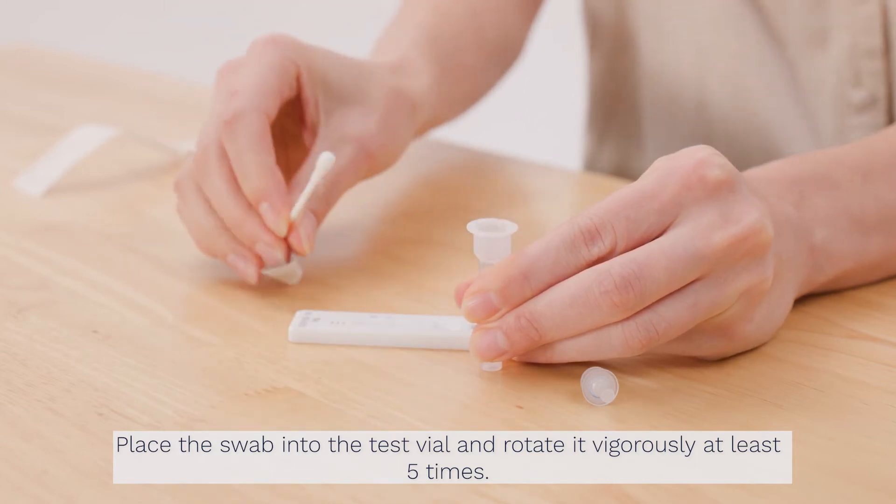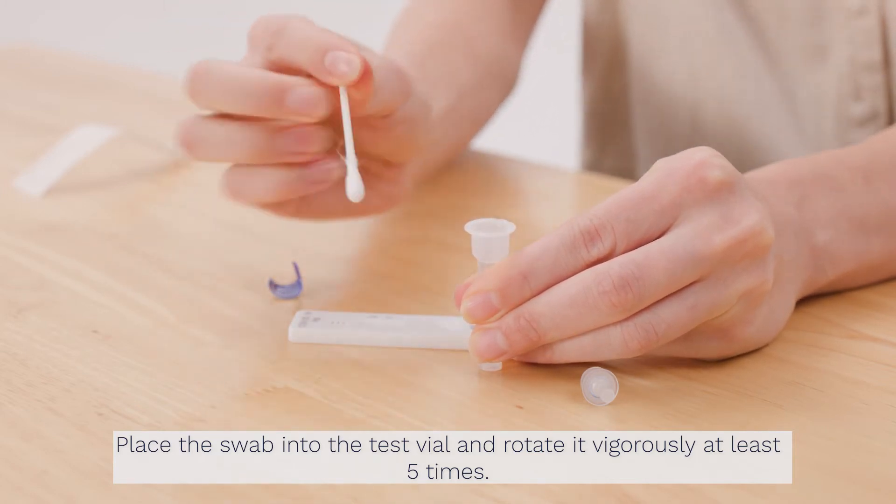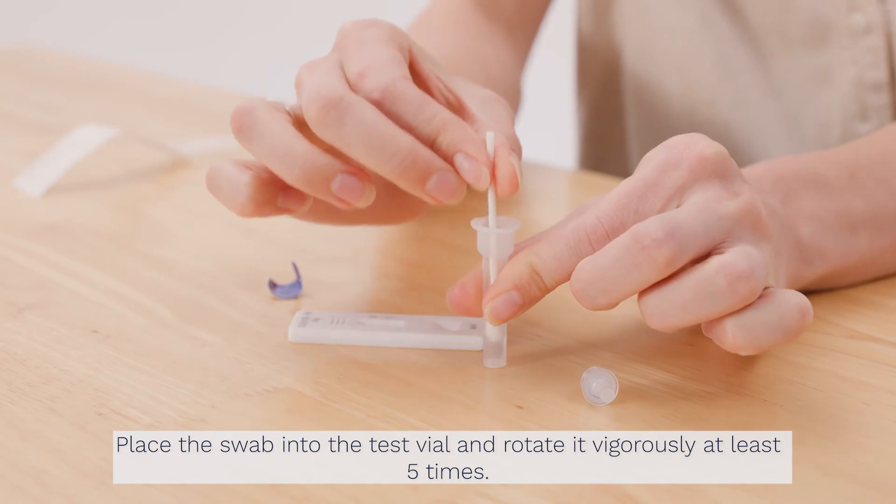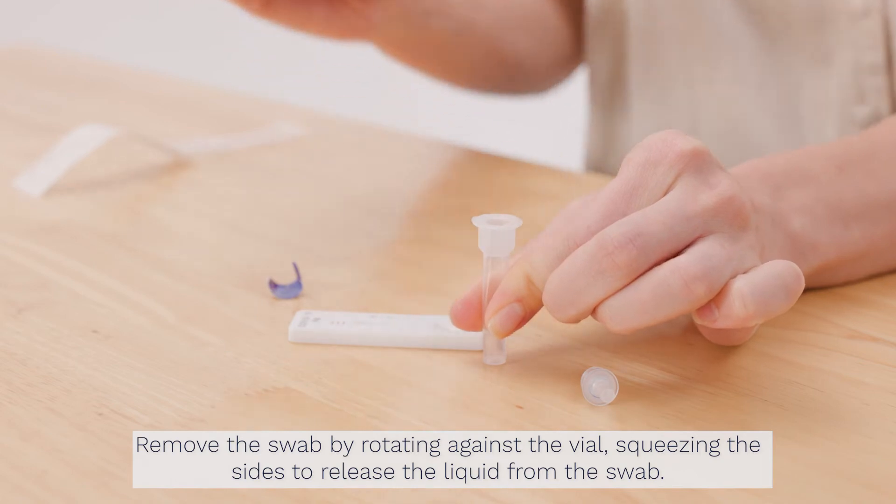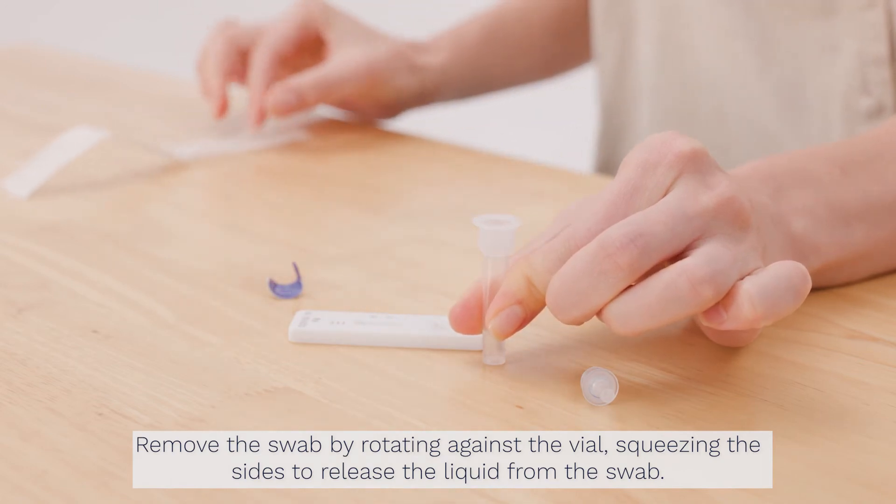Place the swab into the test vial and rotate it vigorously at least 5 times. Remove the swab by rotating against the vial, squeezing the sides to release the liquid from the swab.